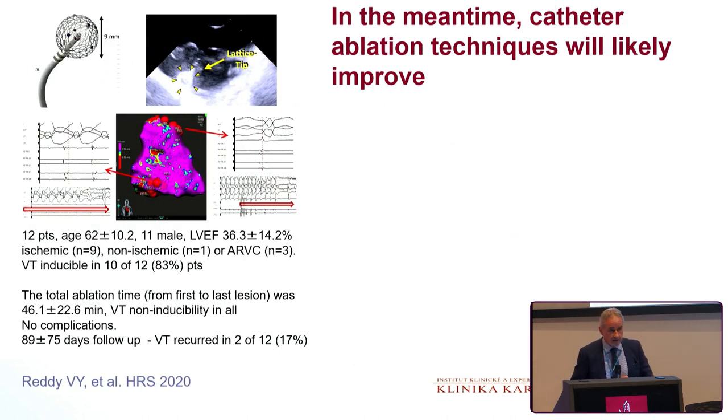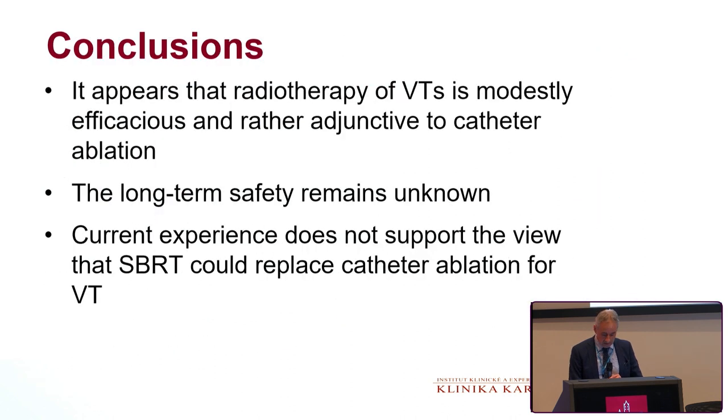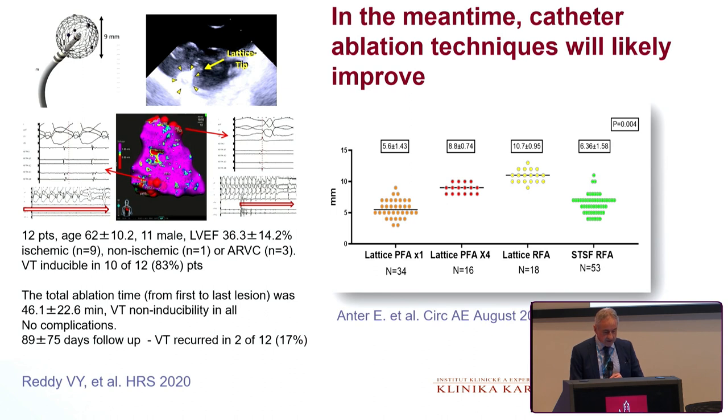And don't forget that there is development of technology, and we discussed already something about pulsed field. This technology was not yet used in ventricular myocardium, but we used this in a small study. We used this Affera Sphere-9 catheter to ablate with a high-energy RF. And in this report, in 12 patients, we had very good success in two centers in Prague. I think there was also one center, I don't know if Pierre Jaïs was there, I don't remember exactly. And this was quite interesting and a very successful modification of the substrate.